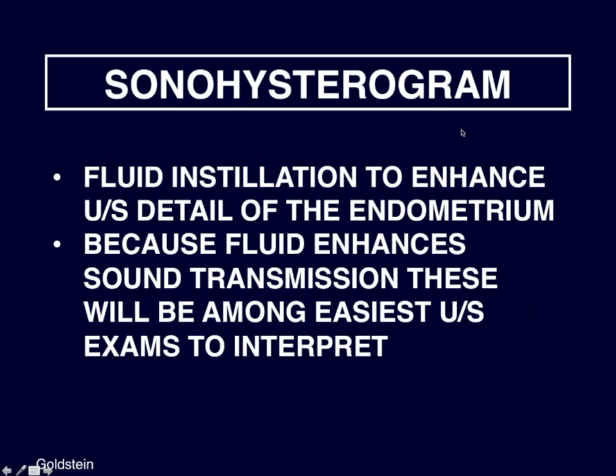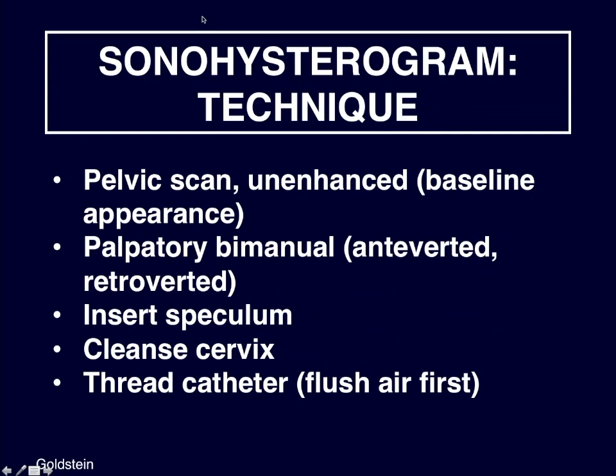Go into a little detail about the sonohysterogram. It's using fluid instillation to enhance ultrasound detail of the endometrium. We know that fluid enhances sound transmission, so these will be among the easiest ultrasound exams you will ever have to perform or interpret. I mean, the reason ultrasound is such a home run in obstetrics is the baby's in a bag of water. Fluid is your friend. It enhances sound transmission. The technique of sonohysterography is relatively simple.